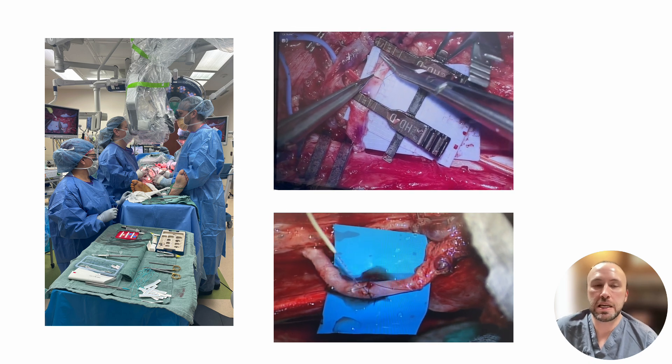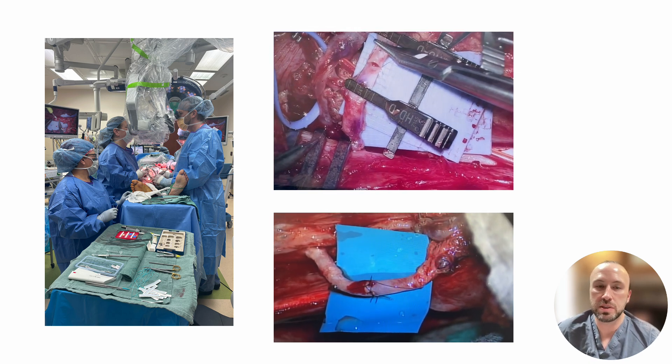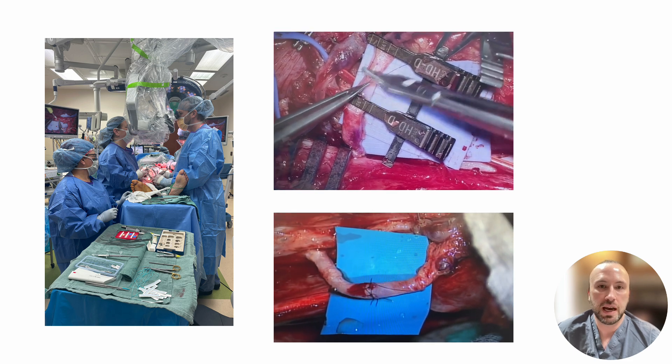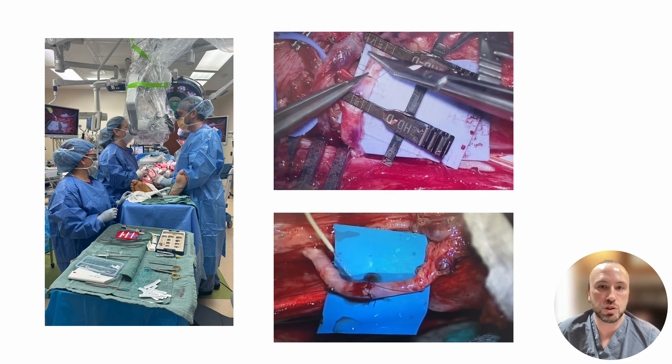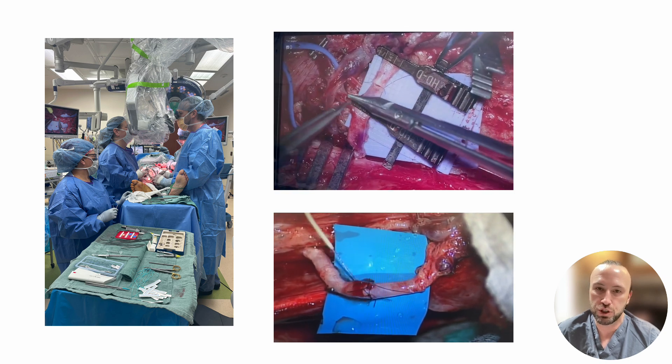In free flap surgery, in order to keep flap tissue alive, we reconnect it to new blood vessels at the recipient site with an operating microscope. After surgery, a handheld acoustic Doppler allows us to evaluate the blood flow to the flap so we can monitor for problems with flap perfusion.